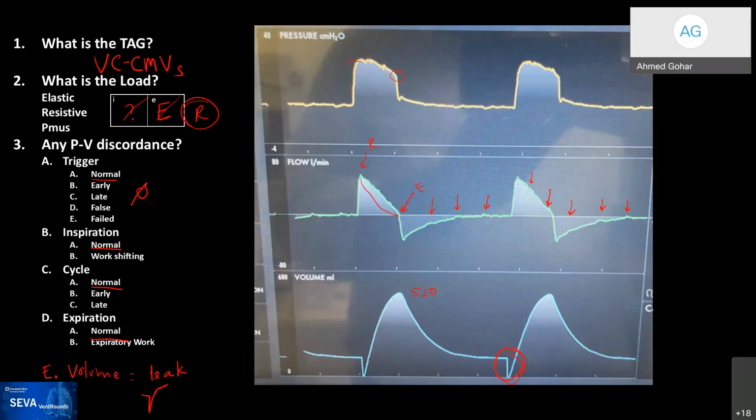And the last thing is the ease of being able to monitor the peak versus the plateau would give me more reassurance, and everybody more reassurance, because we're going to be seeing high pressures with those patients, and everybody will be freaking out about the peak pressure. But the ability to easily monitor the plateau pressure would be helpful for everybody to be reassured that we're avoiding lung injury. So all good comments.